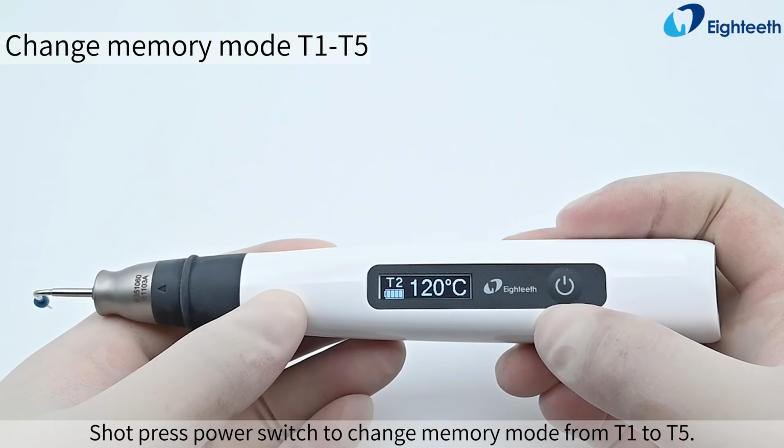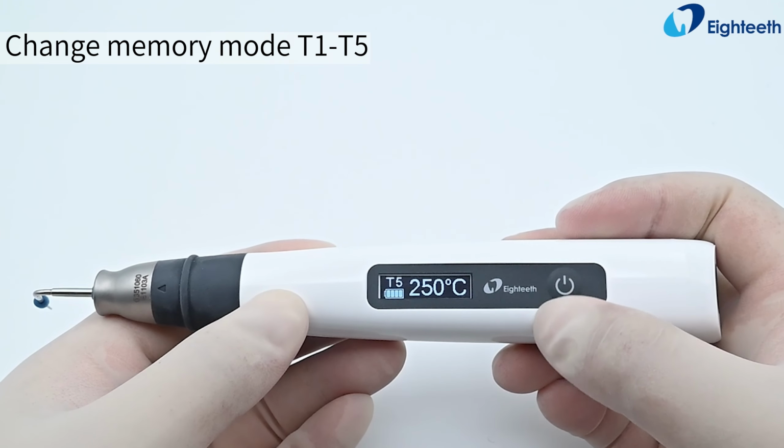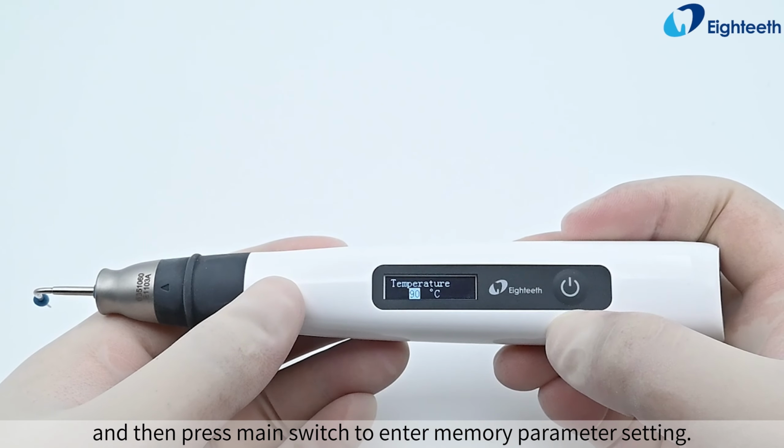Short press power switch to change memory mode from T1 to T5. Press power switch and then press main switch to enter memory parameter setting.